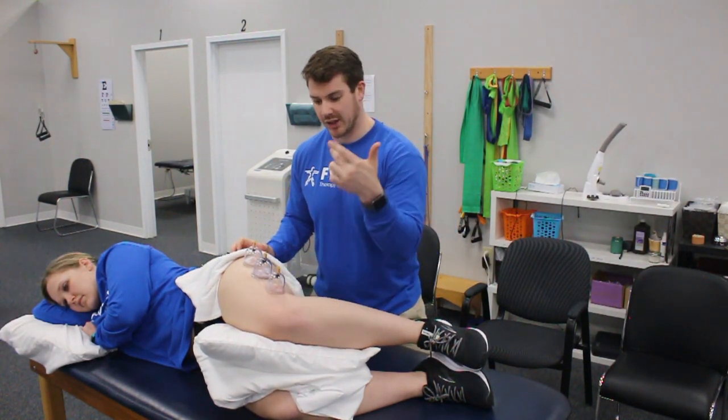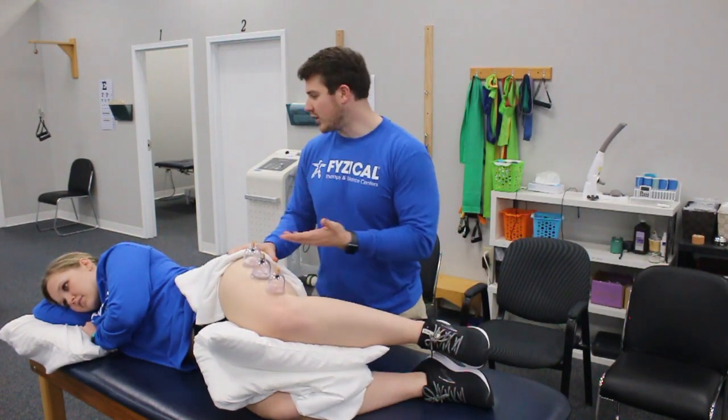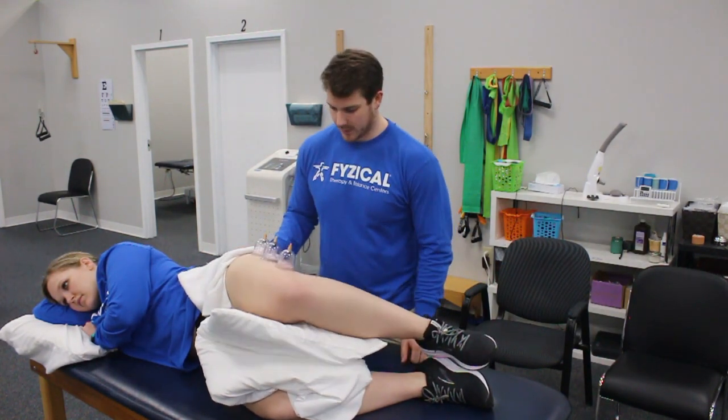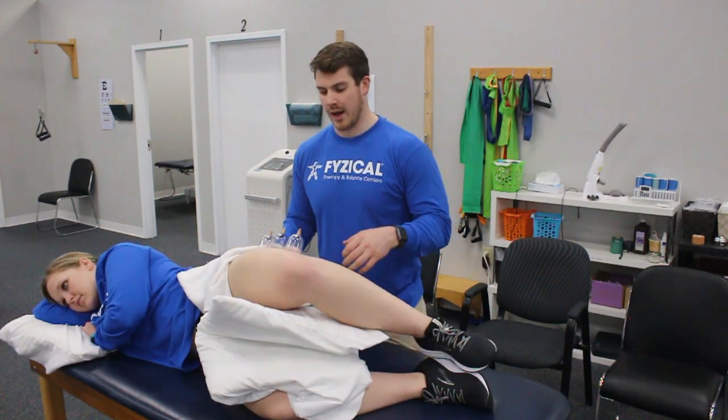I'll have Megan just lift her knee up and then back down — five times: two, three, good, four, and five.